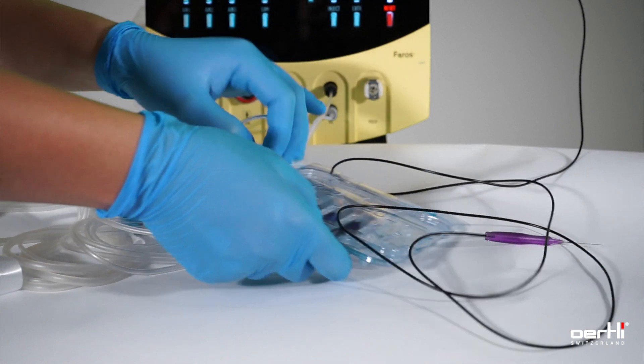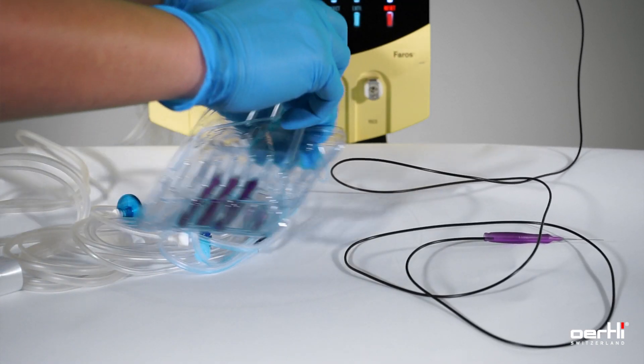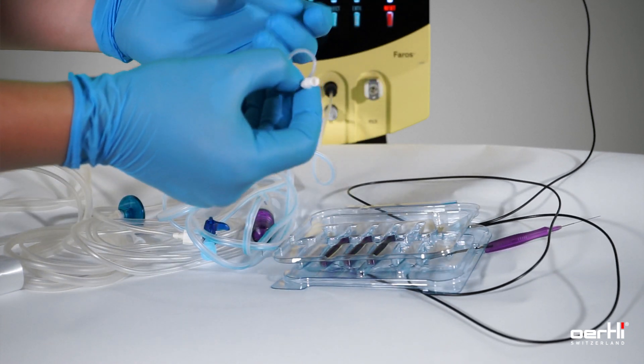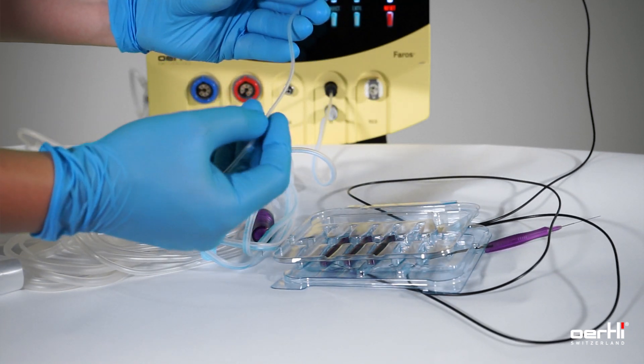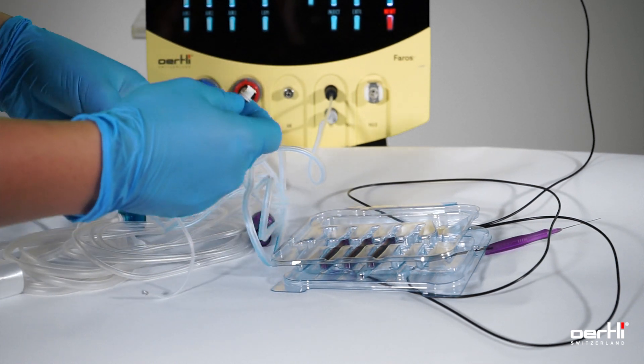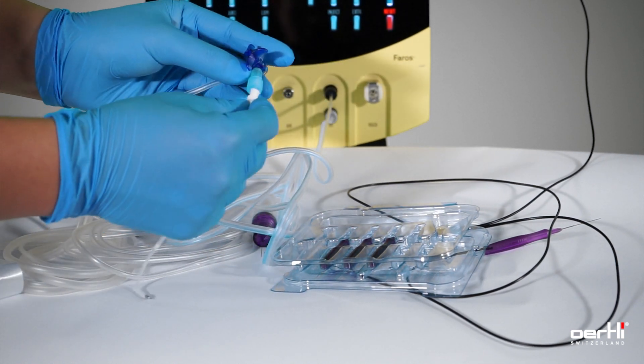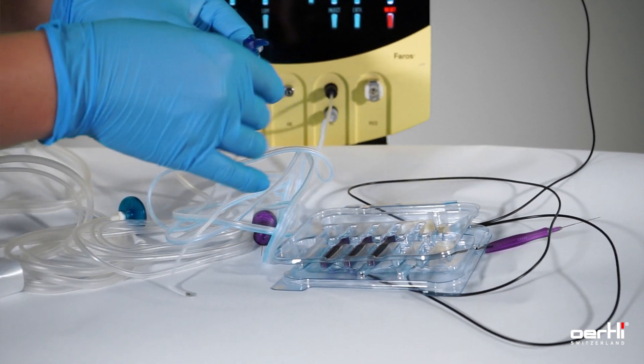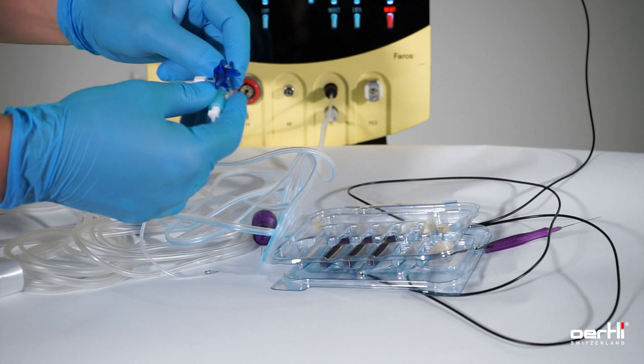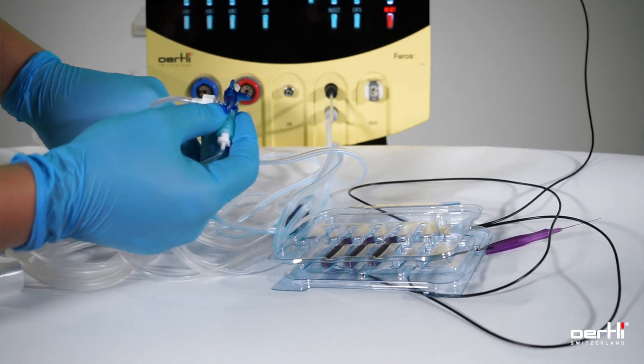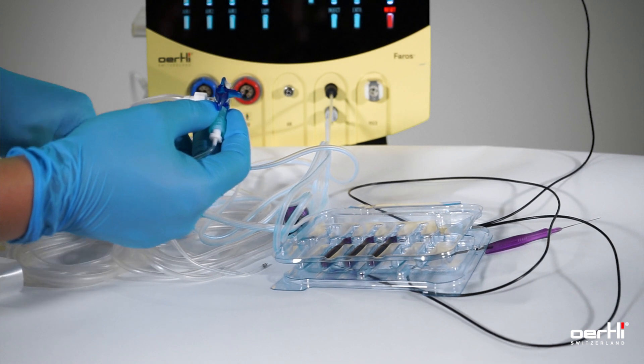Out from your trocar box, you use that short infusion line and connect it with the three-way stopcock. And the final port, you connect with the irrigation line from the cassette.